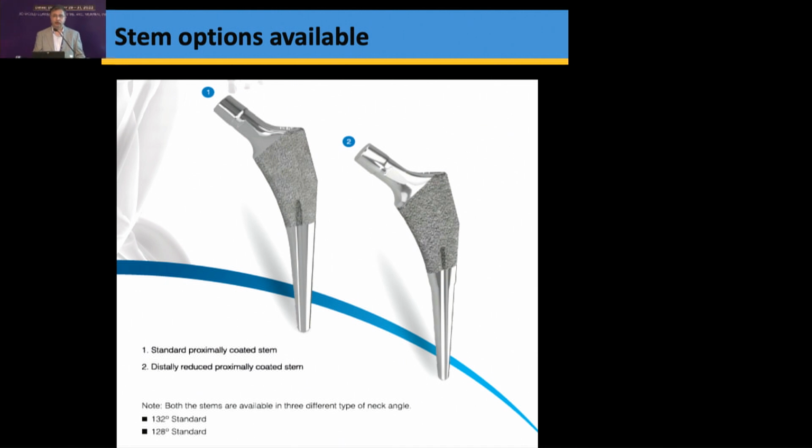You can have a standard offset. You can play about with the offset intraoperatively. So given these two reasons, I suggest there's good reason to be open-minded about these kinds of stems simply because you have the option to play about intraoperatively. Not every patient is suitable for a fully coated stem.